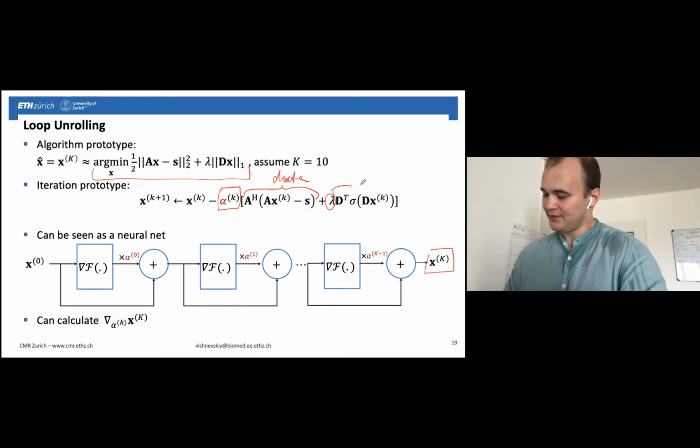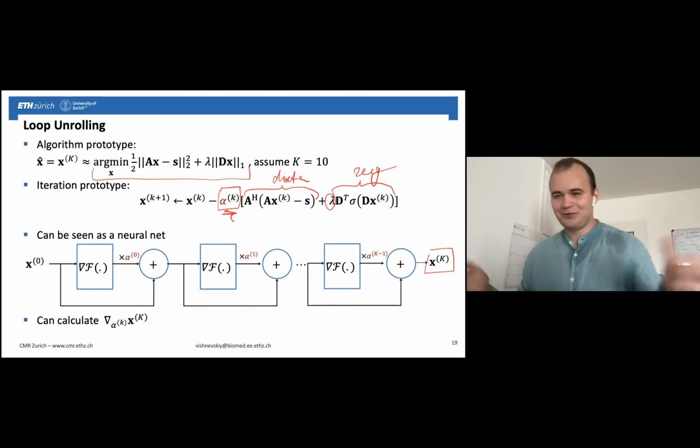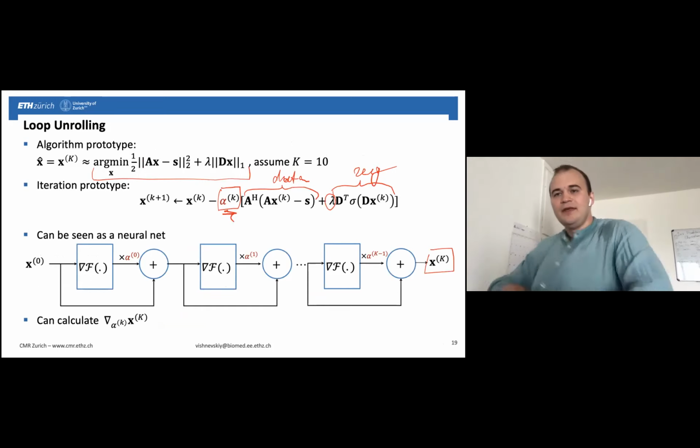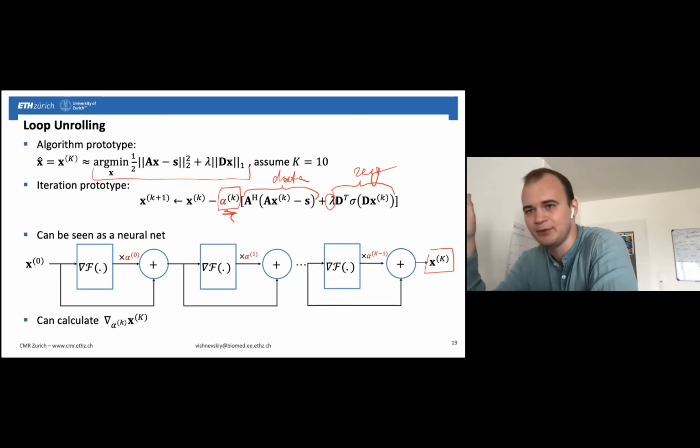It's the gradient of the regularization term. And this parameter that weights them is done to optimize better. And we don't modify initially this data term because, in undersampled reconstruction, we just undersample the data, right? We calculate the Fourier transform on a computer and undersample it. So we assume that the model is followed exactly, plus some noise on top.